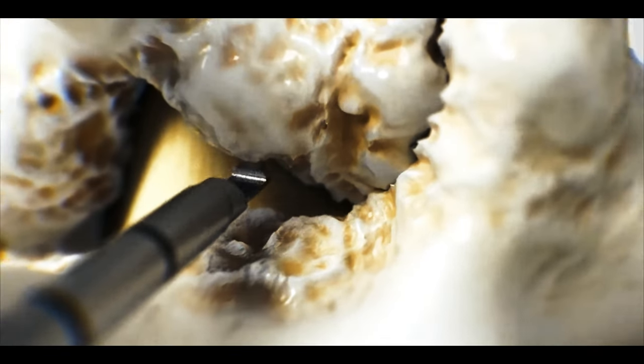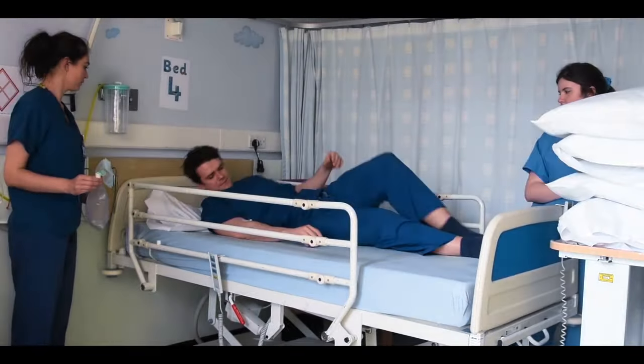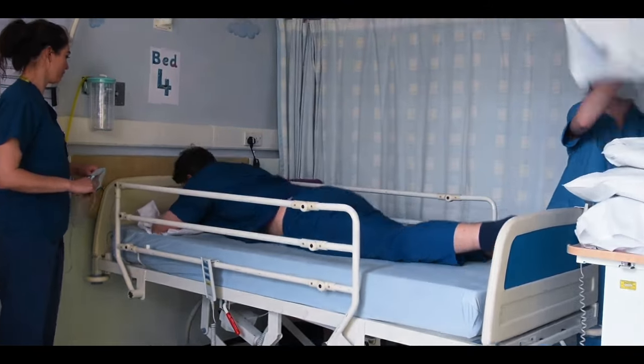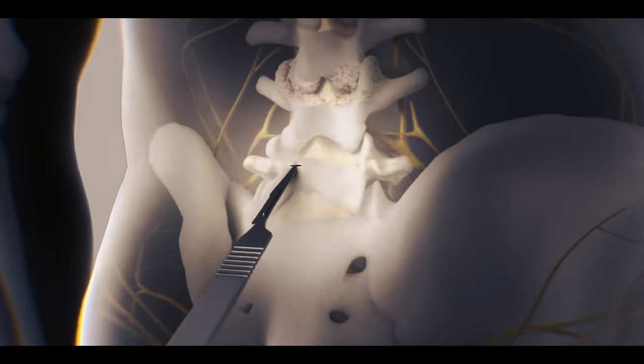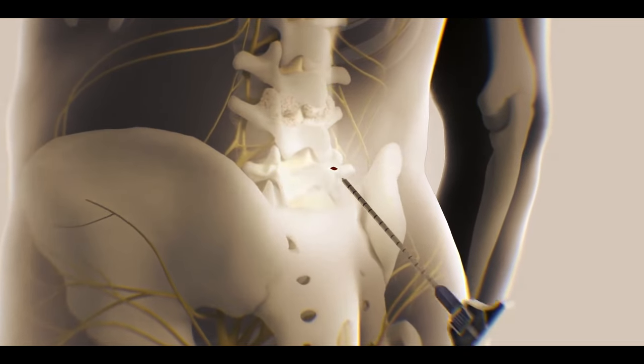Mild is an outpatient procedure in which patients lie with their face directed towards the examination table and their back is numbed to make a small cut to access the spinal canal.